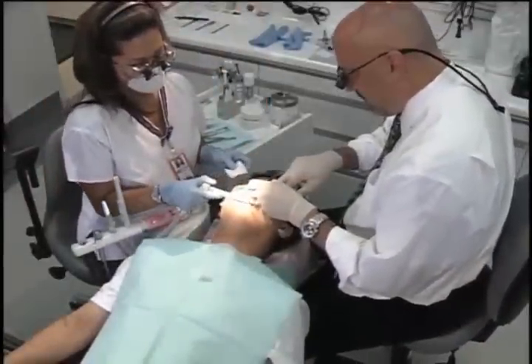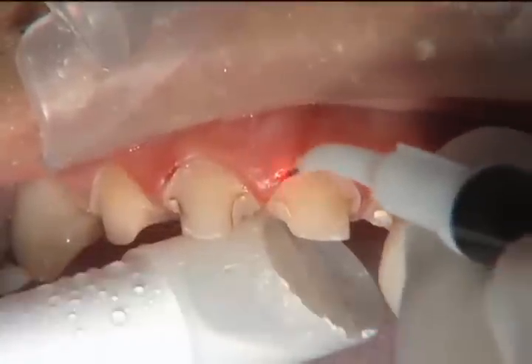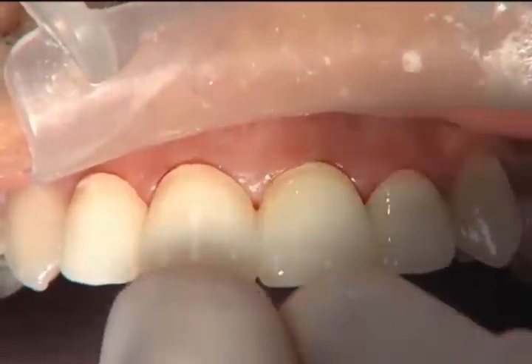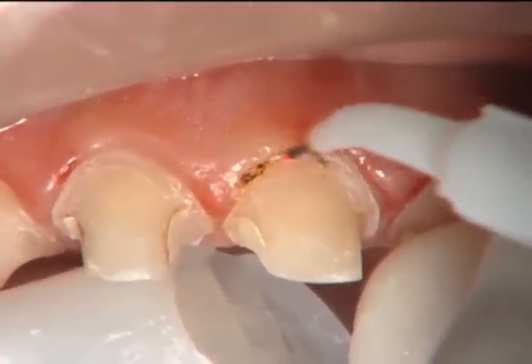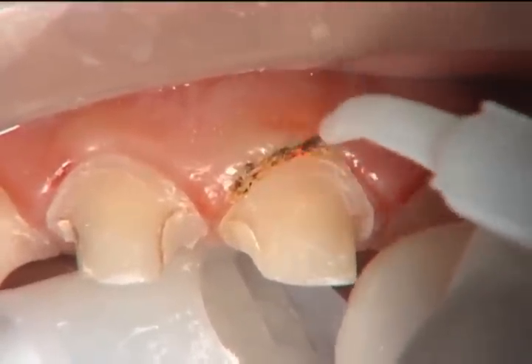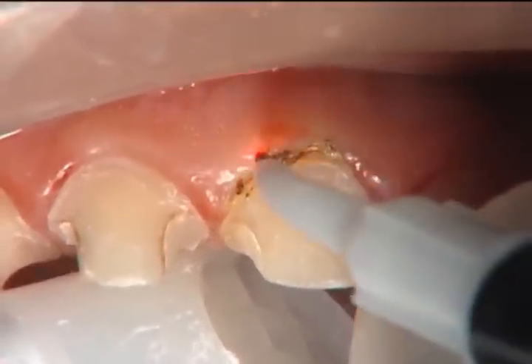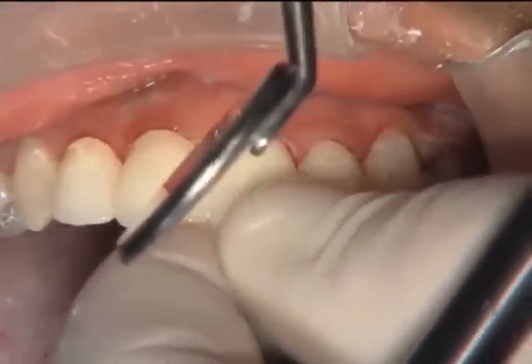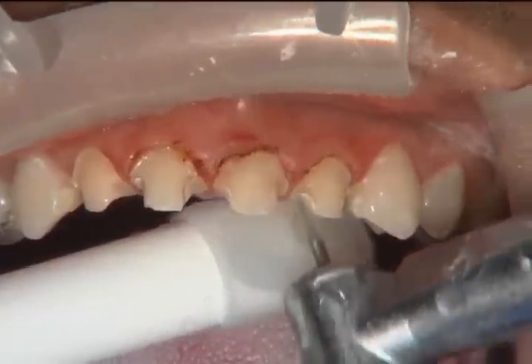Here we're using our diode laser — the Laser Smile from BioLase — going in and removing some tissue. I'm just freehanding this; we could mark it with a marker or put little holes with an explorer, but this one's pretty easy to see. I'm just trying to match a couple of teeth — re-contouring the central incisor on the right to look like the central incisor on the left. Then we try the BioTemps back on to confirm we've reduced enough. Once we've brought the tissue back to where it needs to be, we'll drop our margins down to that new gingival level.